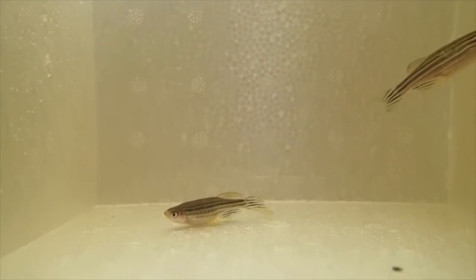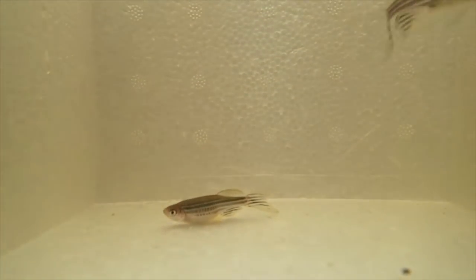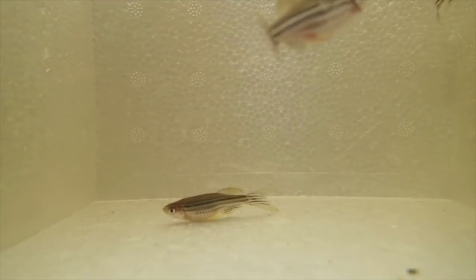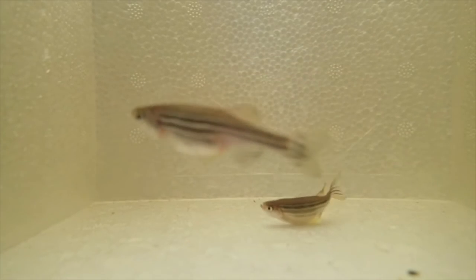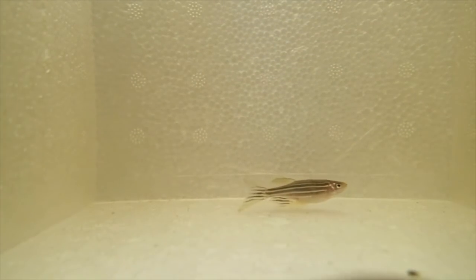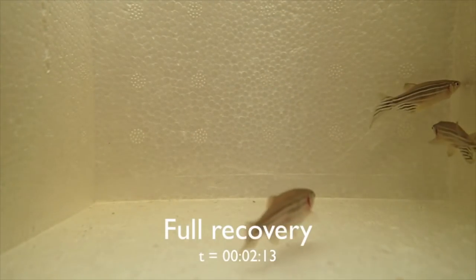For small fish it's okay to let them swim like this, but if you are doing surgery on a fish and your client is watching, at this stage it's advisable to keep your hand on the fish. Sometimes it might cause the client some distress when they're waking up looking a little groggy and swimming around. Here now the fish are pretty much fully recovered.